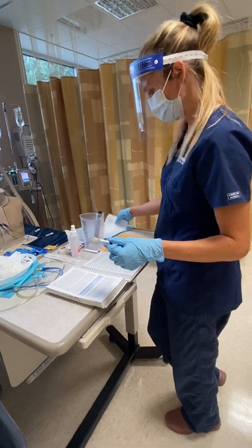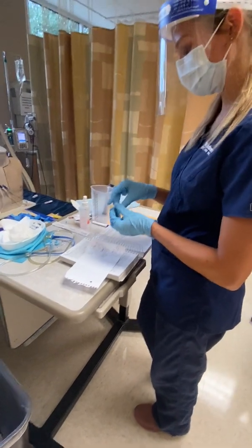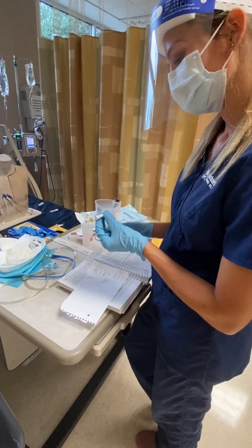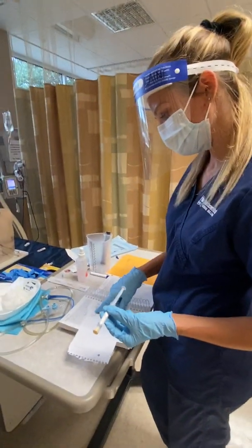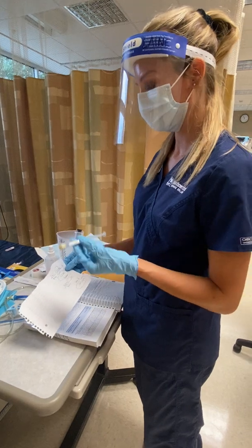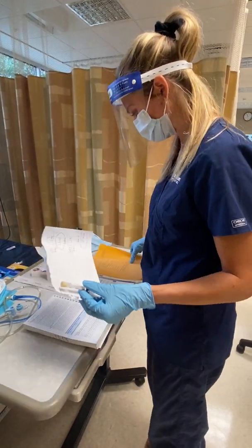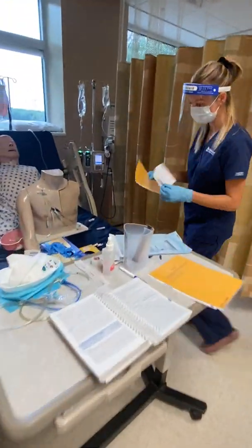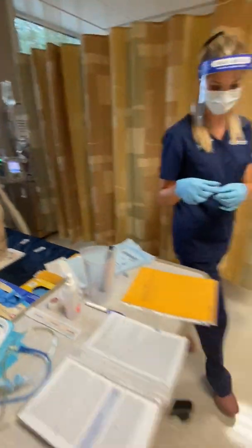And I did my math here for the Zofran, and we have a pre-filled syringe of Zofran available, and it's 6 milligrams in 2 mils. I'm checking my expiration date, and it hasn't expired. So doing my math, she needs 4 milligrams of Zofran, and so that would be equivalent to 1.3 mils of Zofran in this pre-filled syringe. So that's my math for that. Okay, I'm gonna get this all set up for you, and then get this dose accurate.